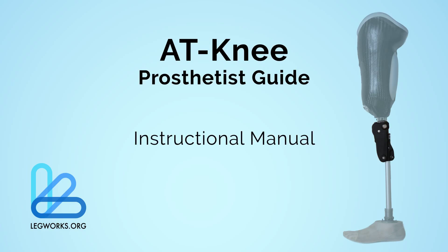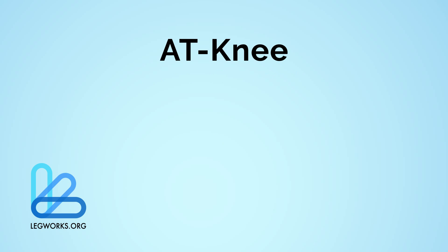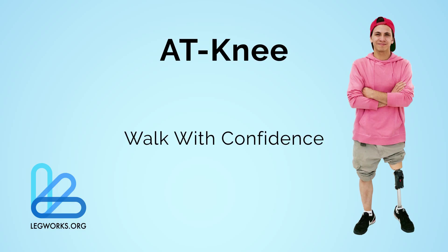Please refer to the instructional handout and manual for more information on how to set up the AT-Knee and fine tune the adjustments to your patient's needs. We hope this helps you begin walking with confidence on the All-Terrain Knee.